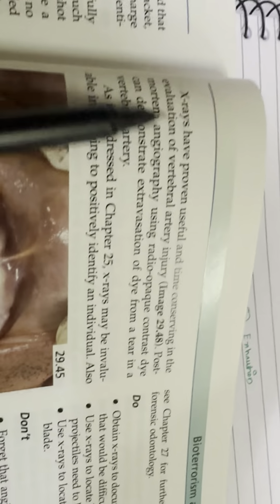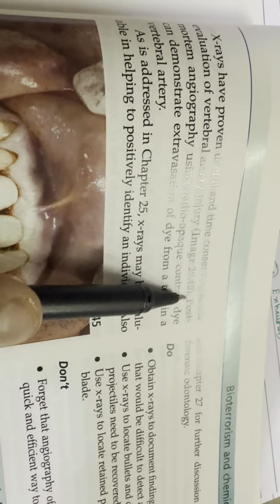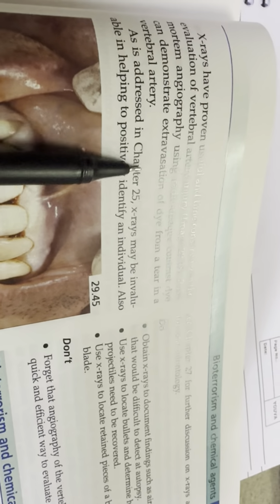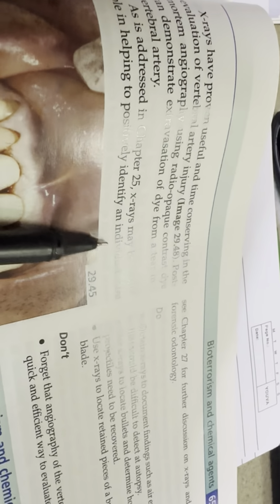X-rays have proven useful and time-conserving in the evaluation of vertebral artery injury. Postmortem angiography using radio-opaque contrast dye demonstrated extravasation of dye from a tear in a vertebral artery. X-rays may be invaluable in helping positively identify an individual.